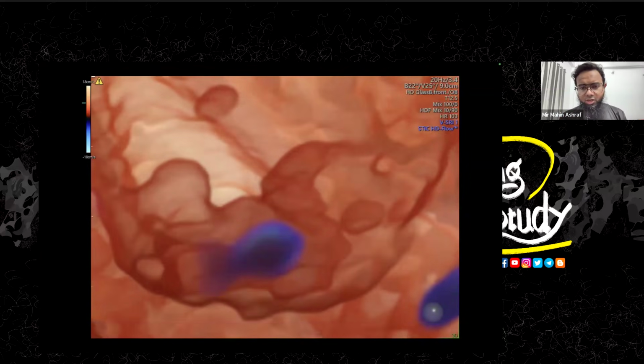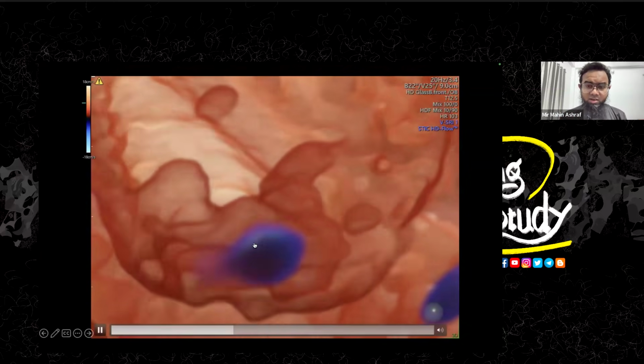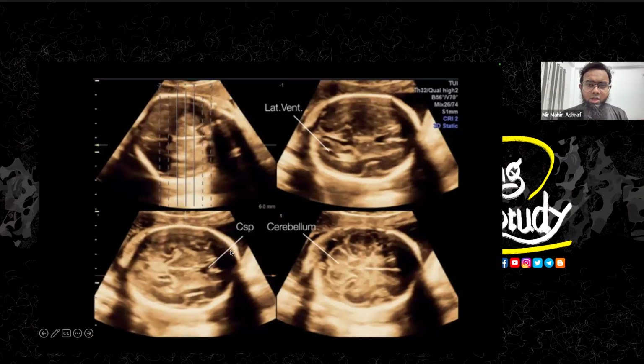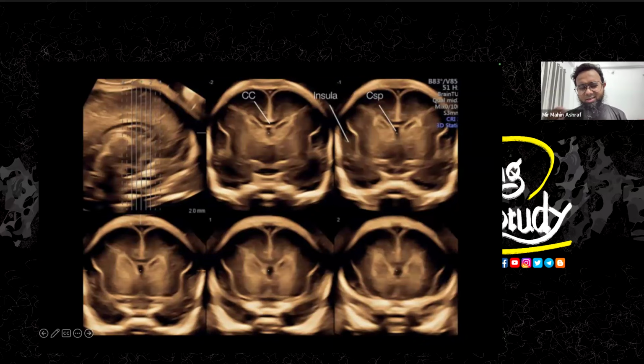So we can show you the fetal heart, embryonic heart, with this appearance right now. We can also use this multiplanar or tomographic imaging to assess the cranial structures. Our machine can also measure all the structures here with proper marking, but still they are not so reliable, so better to do it manually.